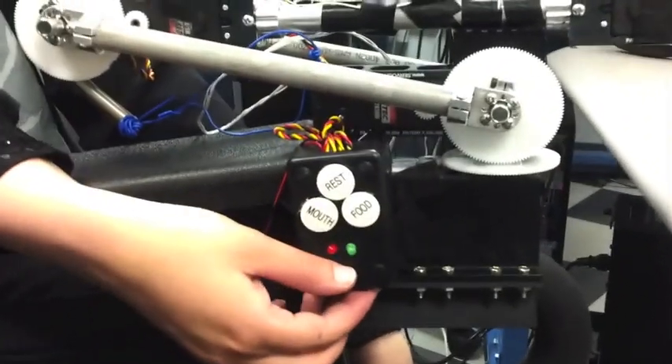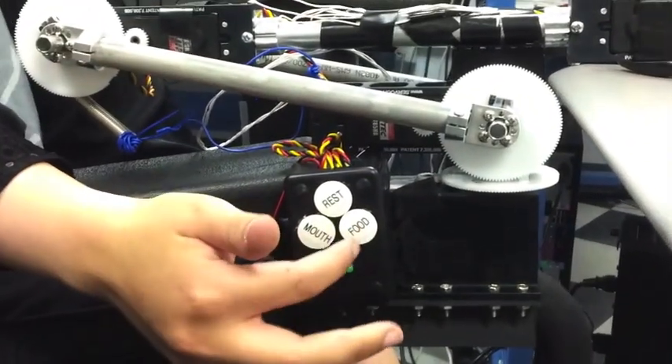We begin by pressing the power button down here. Once it's pressed, it awaits user command.